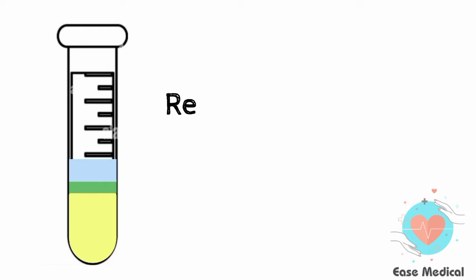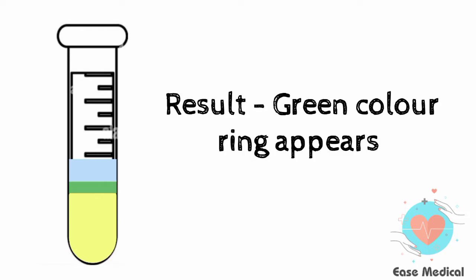Result: a green color ring appears at the junction of the urine sample and reagent, which indicates the presence of bile pigments. Bile pigments are produced due to the breakdown of RBCs.